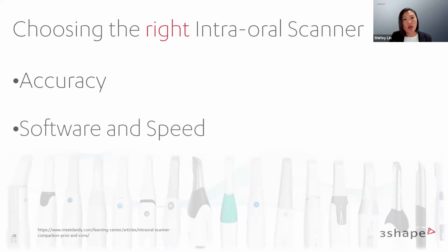Software and speed. Software capability and speed can differ significantly from scanner to scanner. That matters because software powers the scanner, directly impacting performance as well. The ideal scanner will have minimal lag time between scanning and loading images on the screen. But an important thing you also want to consider is how user-friendly the interface is. Are there too many functions or buttons, features that you might not need? Does the software look clean and concise, or is it too cluttered? Things like that are what you need to look for.